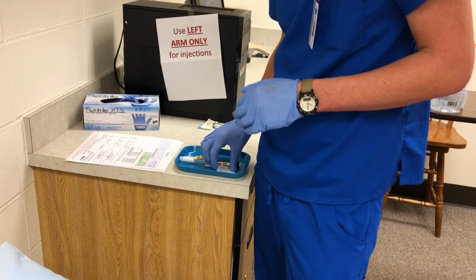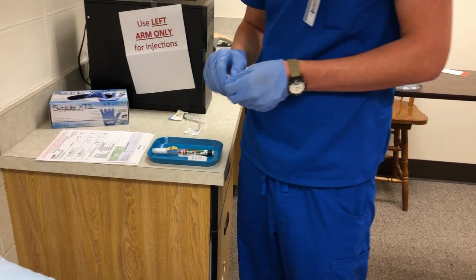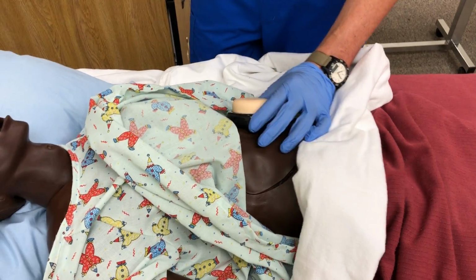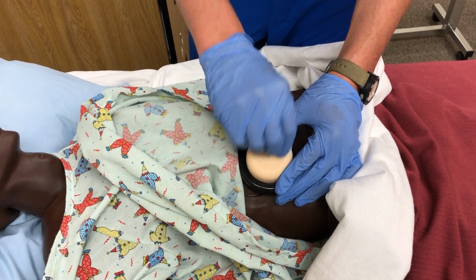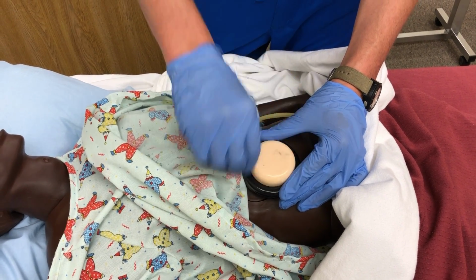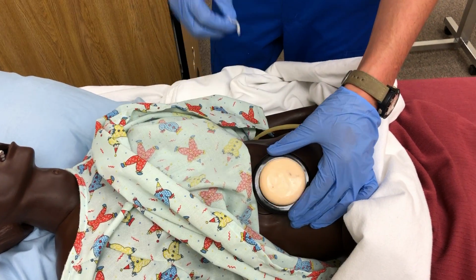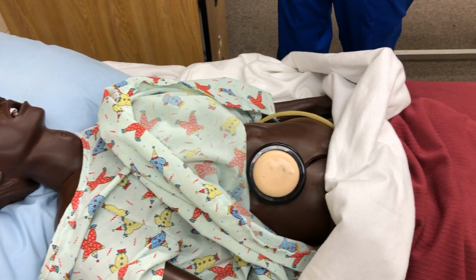Okay, and then for the next one, we're gonna move sites, and we're gonna re-wipe down because it is a new site. So basically we're just gonna move it over here. So this is a new site. We're gonna go like this, go from inside to outside. Okay, please don't fall. So that one's ready.